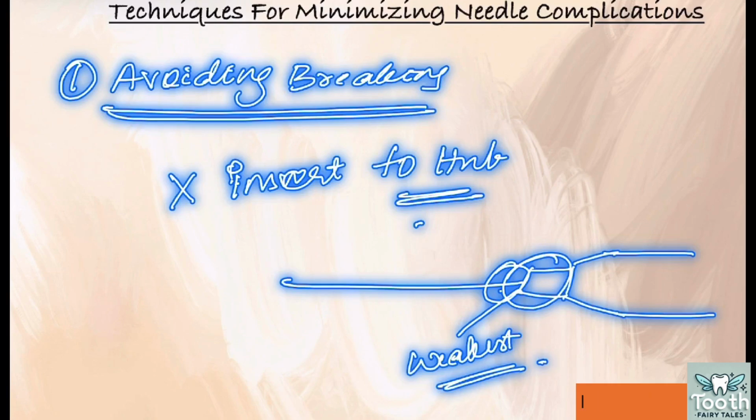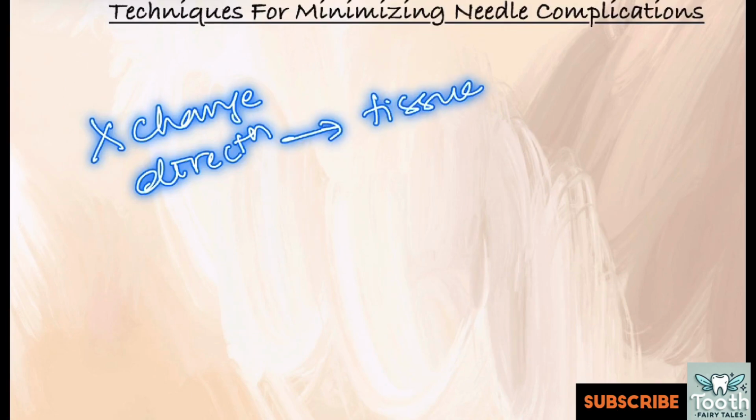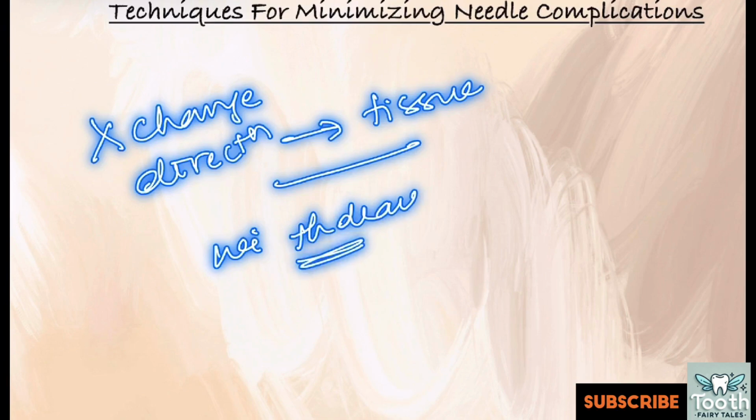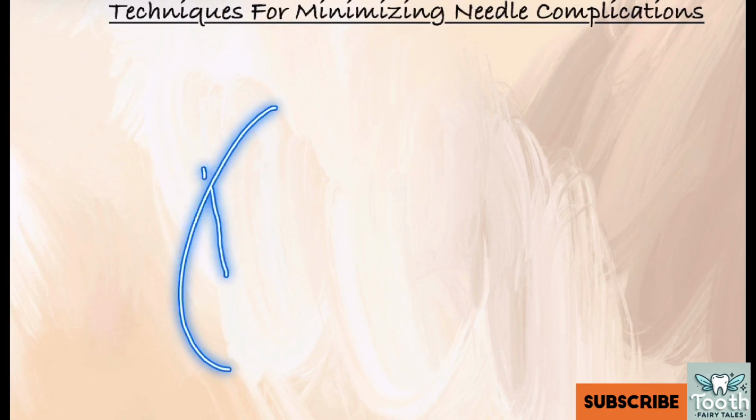Only insert the needle fully when absolutely necessary for the procedure. Repositioning: never change the direction of the needle when it is embedded in the tissue. Always withdraw the needle first, almost fully, before making any adjustments. Withdraw the needle fully and then do the adjustments.